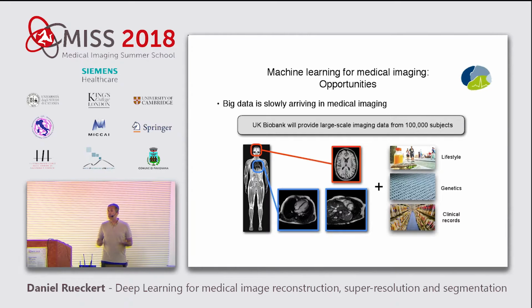And if you wanted to, for example, play around with graph convolutional neural networks, all of this data includes fMRI. So you can deduce more than 100,000 brain networks from this data set. They have cardiac imaging, and I'll show you some more examples of this later on. It's not only static imaging, but actually dynamic imaging.